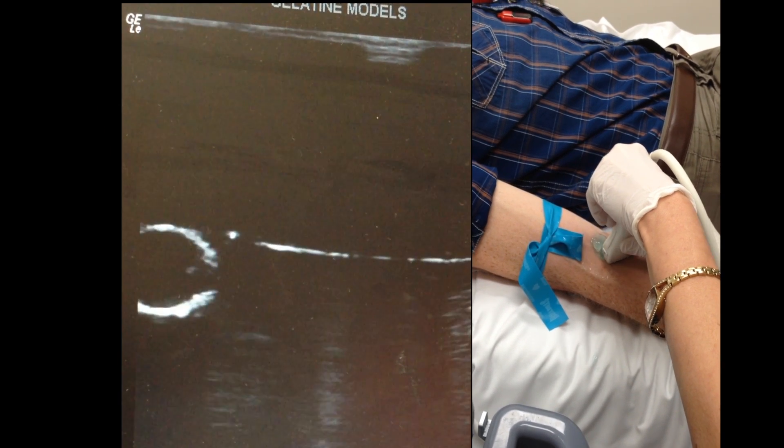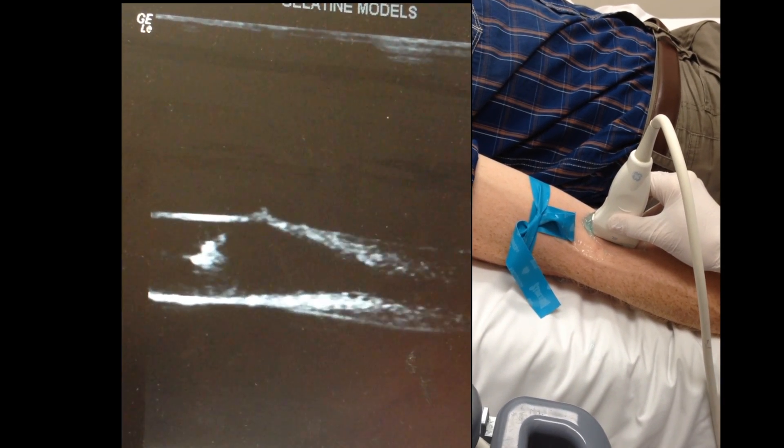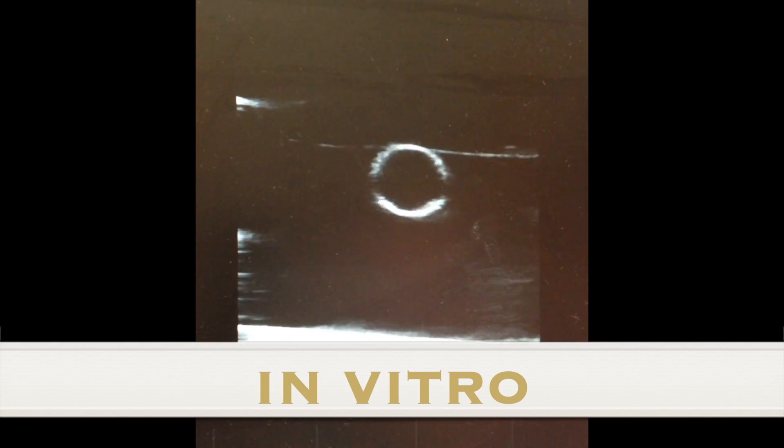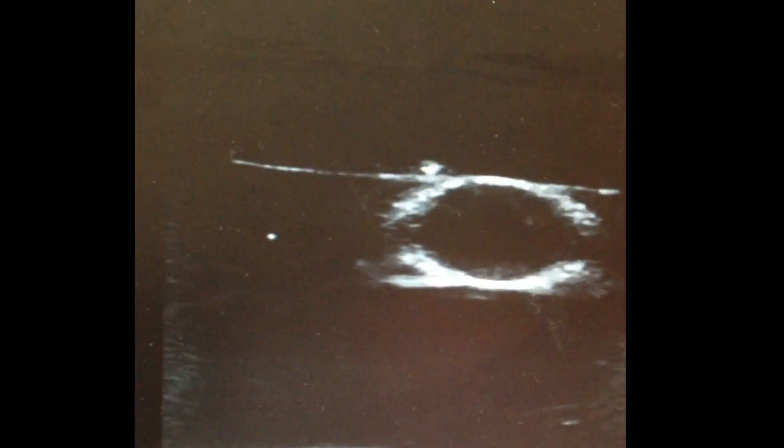Here it looks as if the needle is right in the centre of the vein. However, that white dot could be any part along the shaft of the needle, so it's vital that you learn to turn. This is one of the hardest little manoeuvres with a non-dominant hand because at the same time you're focusing on keeping the needle quite still. When you turn, keep the vein in the centre field. Every time it moves off centre, correct back to the midline before continuing your turn. When you have it completely turned, the walls should be bright and clear like this.